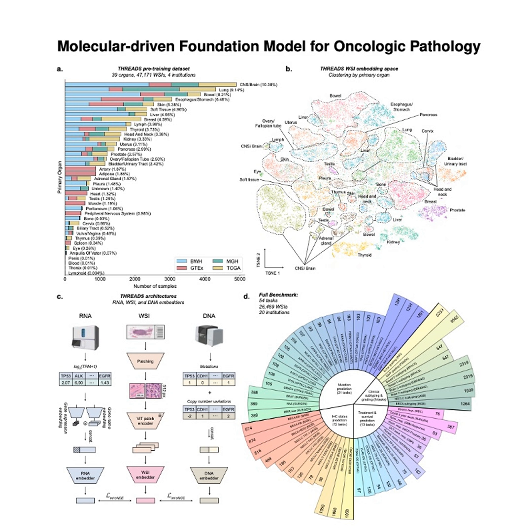And it doesn't try to look at the whole gigapixel slide at once, does it? No, that's computationally infeasible. Okay. It breaks the image down into patches, but importantly, it uses relatively large patches, 512 by 512 pixels. That's bigger than many older models used. And using those bigger patches helps capture more context, right? You see the cell and its surrounding neighborhood, the microenvironment.